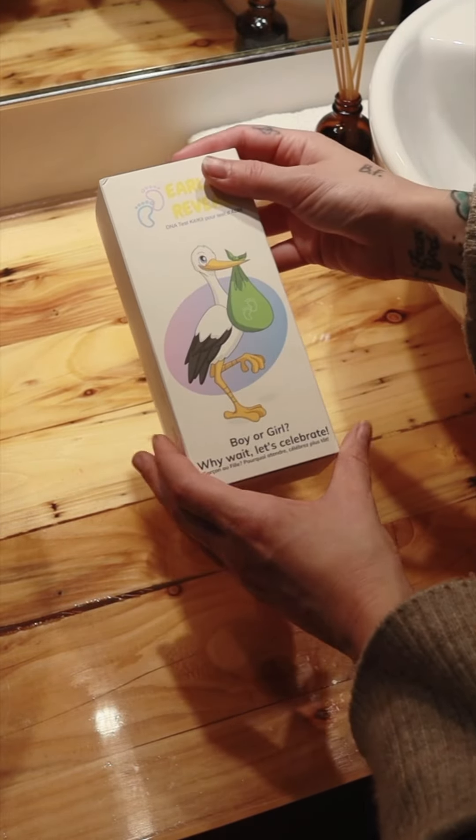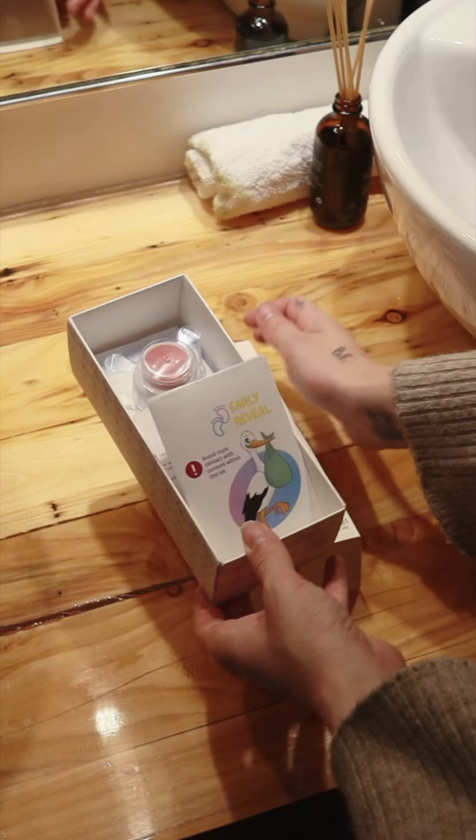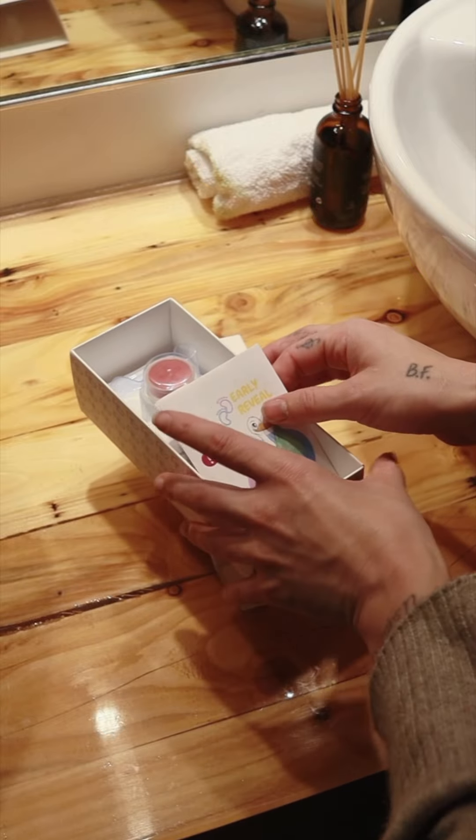Here's how to use the new Early Reveal Tap Test. First, and super important, don't forget to register your kit on the website.